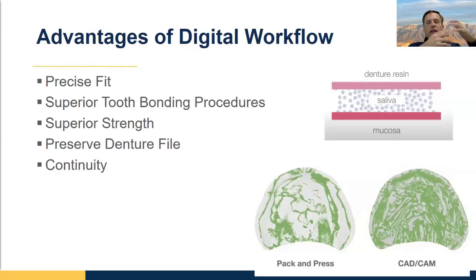So we do things in the laboratory, such as injection, and then post-dams, and we'll have to talk about this later because this is important with digital dentures. Post-dams are basically designed to make sure that even with polymerization shrinkage, we still get intimate adaptation at the distal aspect of the palate so that our upper dentures are more stable. So much better for us if we have really intimate adaptation everywhere and we don't really need a post-dam.